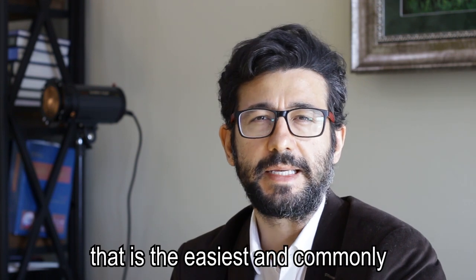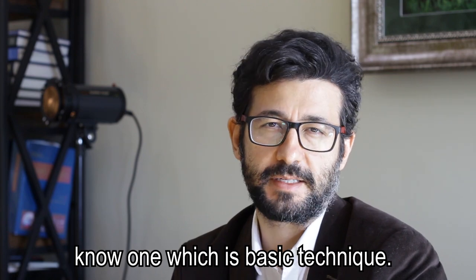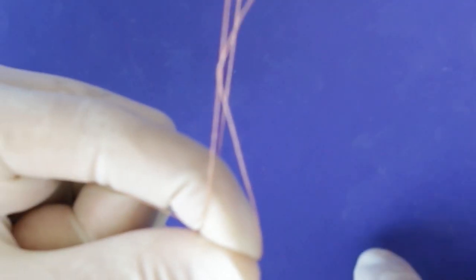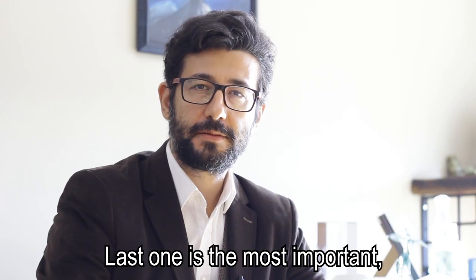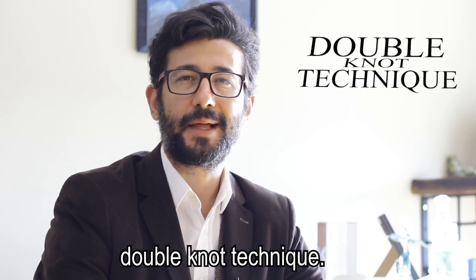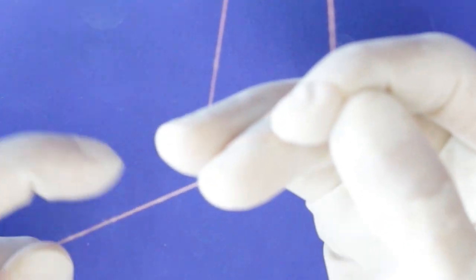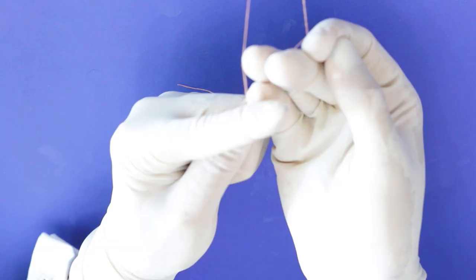Third one is the easiest and commonly known one, which is the basic technique. In this technique, you create a circle with your index finger and thumb. Last one is the most important but barely known one, which is the double knot technique. In this technique, you loop one side with the three finger technique and the other side with the single finger technique.